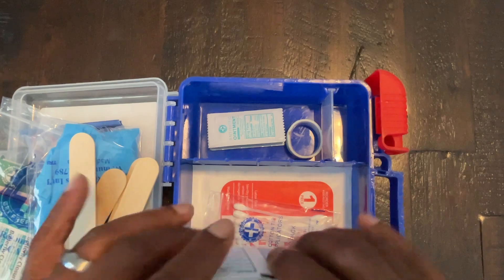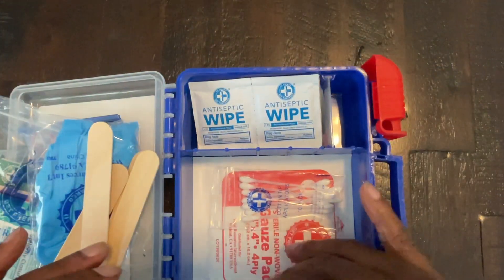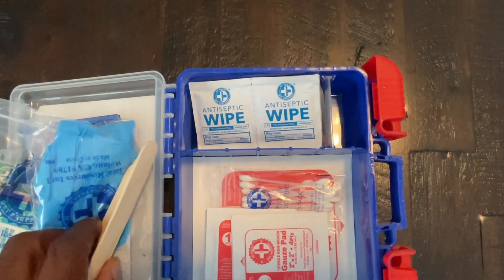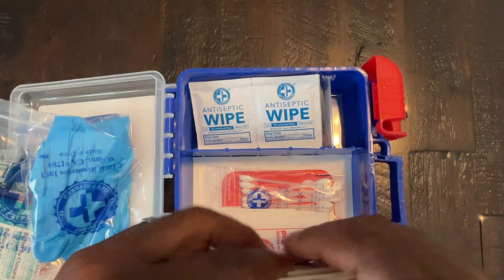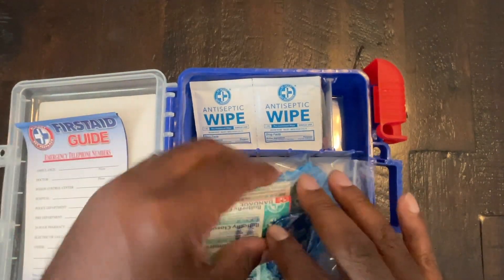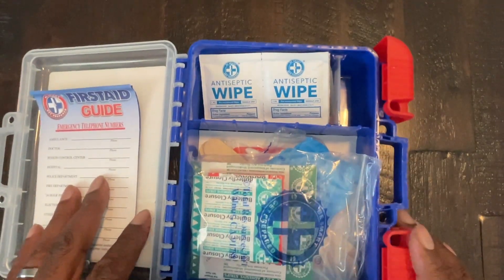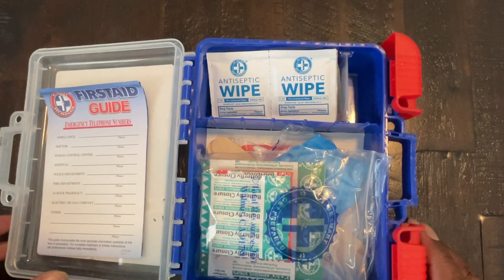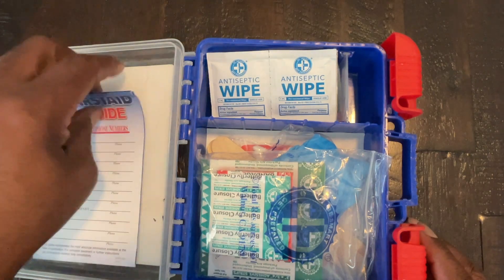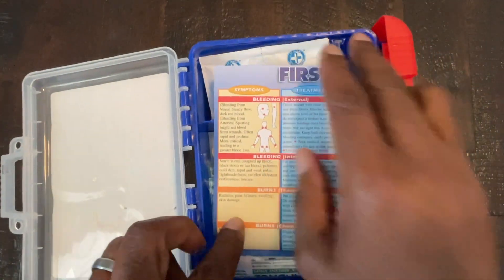So it gives you just some basic first aid capabilities if you're out on the road, you're going camping, or to have in the house or the kitchen if one of your kids scrapes or cuts themselves, something like that. This was a good little kit to have for this purpose and it has definitely served my needs very well. So I definitely recommend it and I hope you found this review to be helpful.